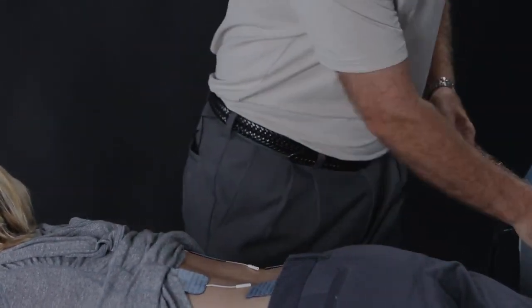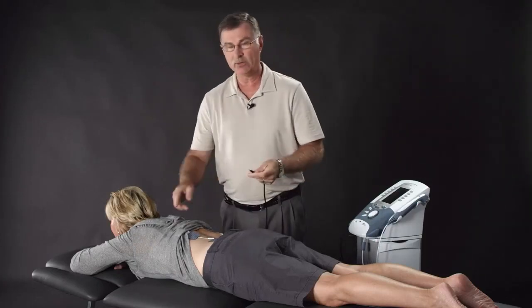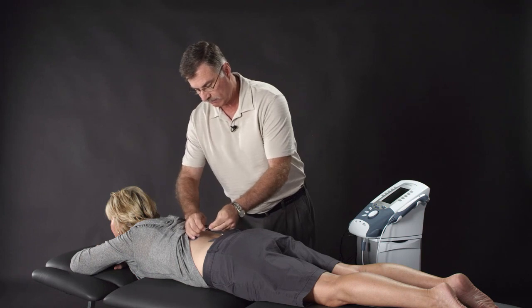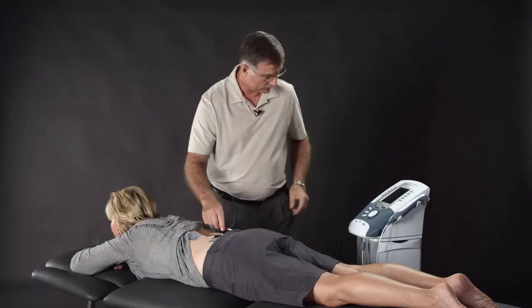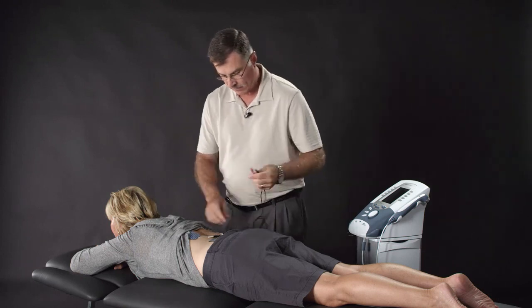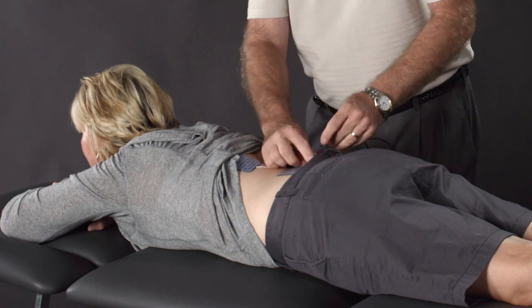The next thing we'll need to do is plug up the lead wires. And again, as we use the channels, we want to make sure we cross them. So we'll take one channel and then we will take the second channel, again, so that the two channels are crossing.